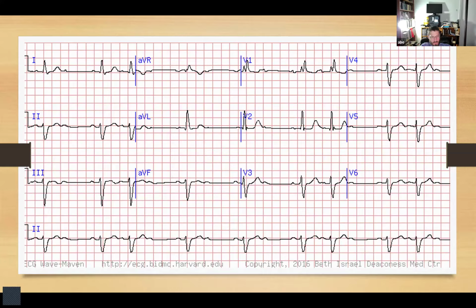It's got extra P waves for some of the beats. They're extra. Okay. All right. So if you look at the PR interval, yeah, go ahead. I was going to say the PR interval appears to be the same. Also, it's not elongated. Okay. All right.